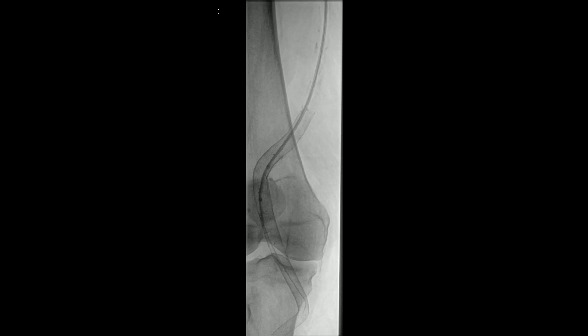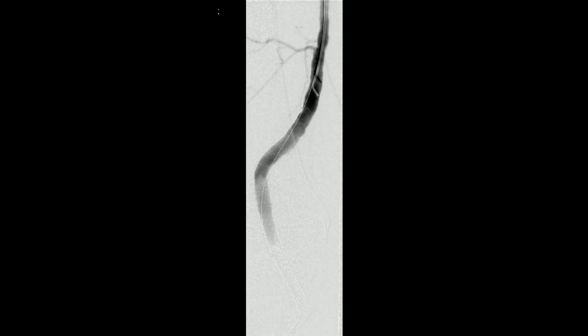The balloon is being brought back into position — you can see the two radiopaque markers on the balloon in that overlap zone. Make sure the balloon is completely deflated before repositioning. Then your completion angiogram with runoff — make sure you haven't knocked something down distally. That's one of the reasons it's important to know exactly what the runoff looks like before you get started. There's a fairly nice result here — it looks like the aneurysm has been completely excluded.